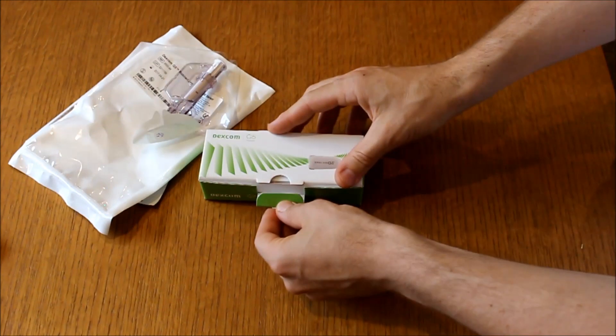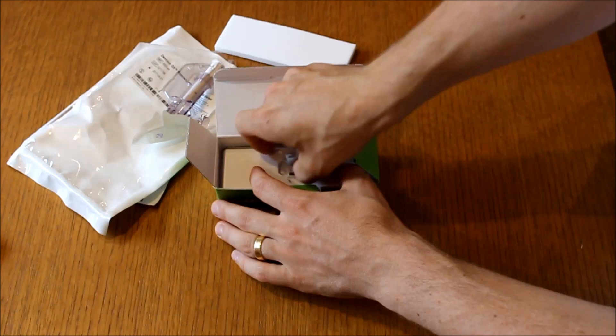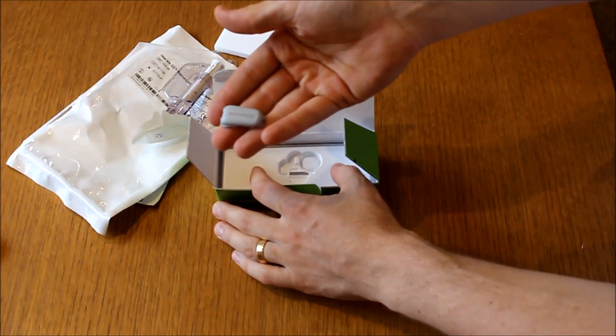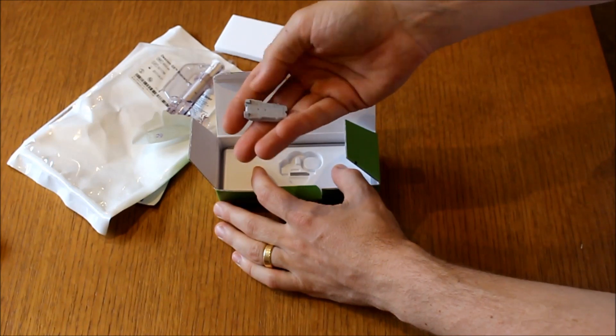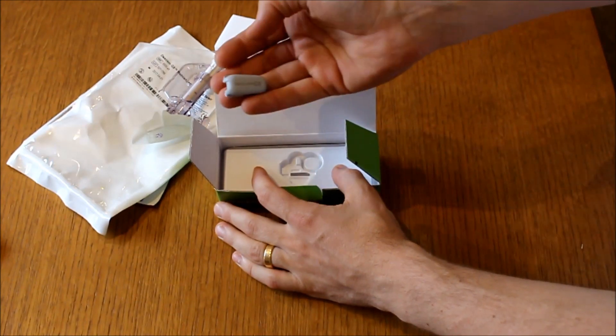The transmitter comes in this neat little box, but after all that packaging, that's our $500 transmitter. This is going to last you three months, so the last thing you want to do is lose it.